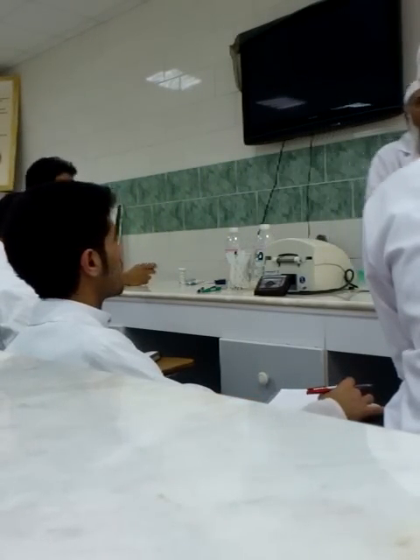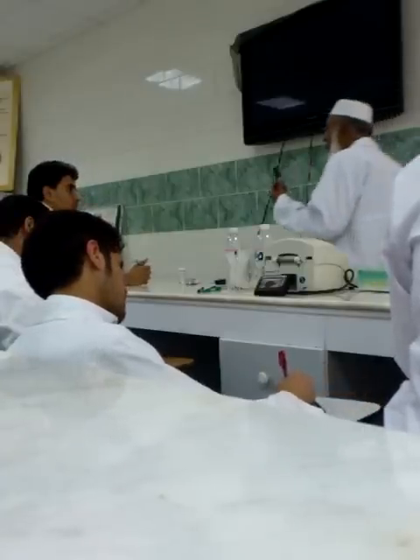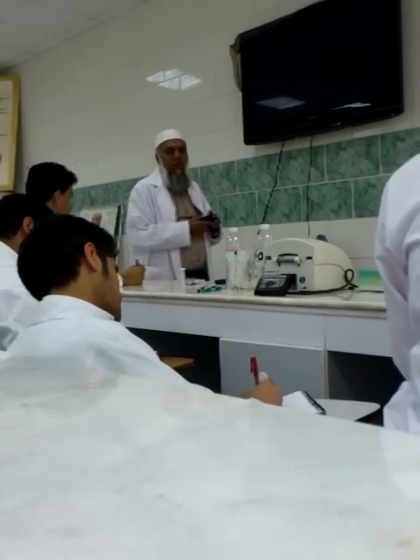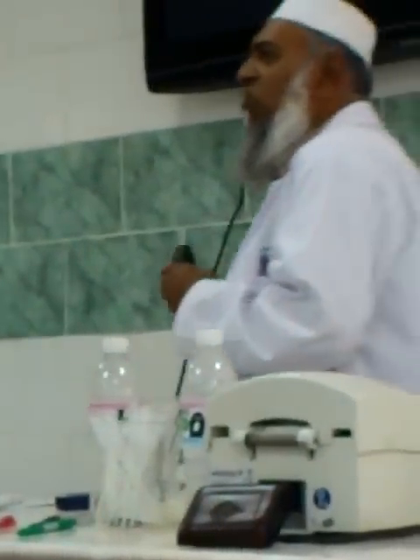So one of the convenient and easy methods to determine the glucose is by glucometer. Why is this glucometer so convenient and important?